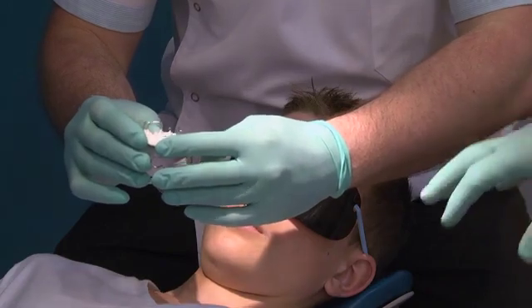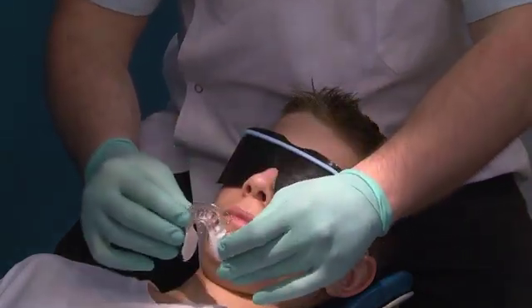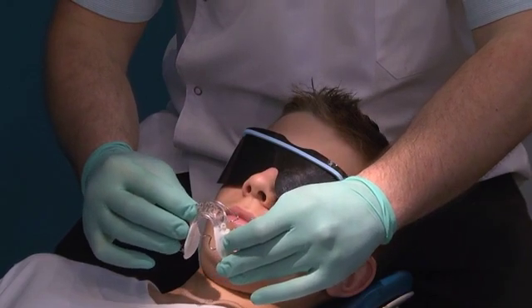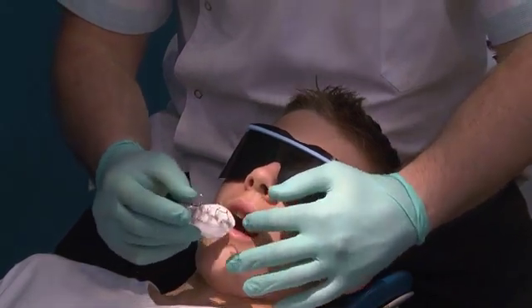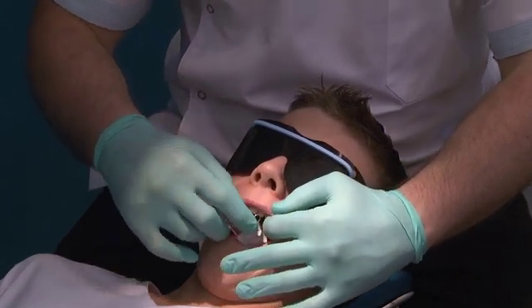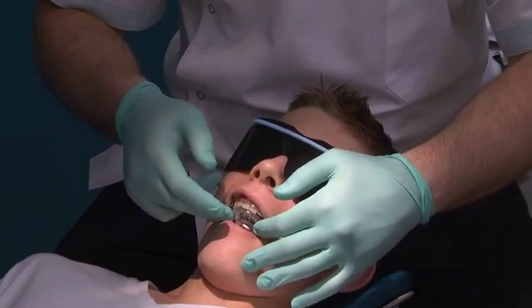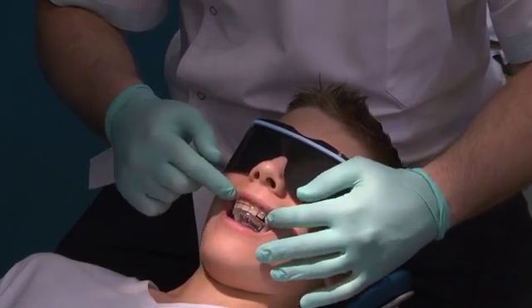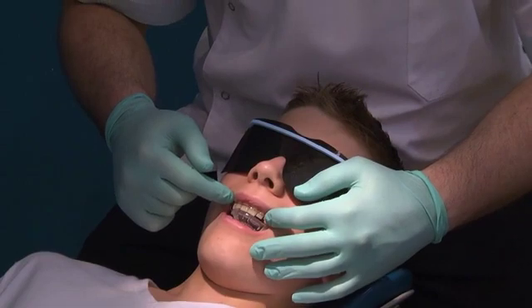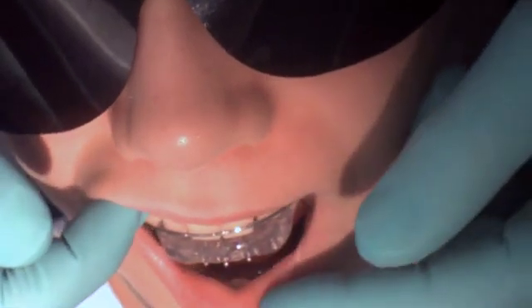Let's do the clinical fit — put the bionator in. That fits beautifully. Chin up, and posture into it.